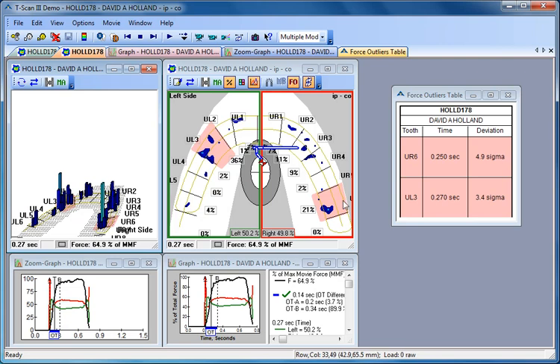Okay, so the software is just trying to point me in the direction of this tooth is high and then this tooth is high. So the indications may be for some minor adjustments at this point in the tooth and maybe at this point in the tooth, because they're high soon in the cycle. Obviously, as soon as we make an adjustment here, the adjustment here may not be required. We'd have to retake the data, but the software is now starting to give me a clue and point me in the direction.